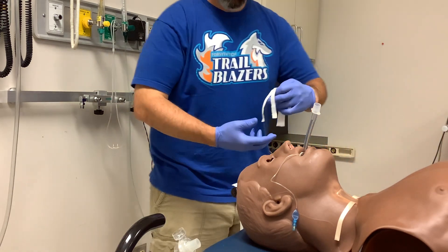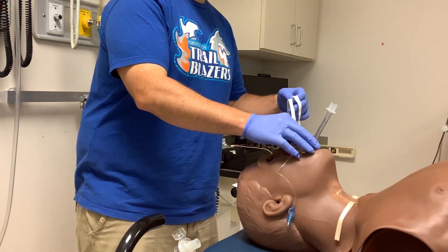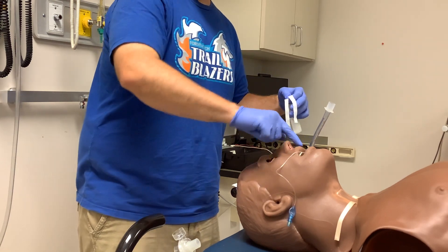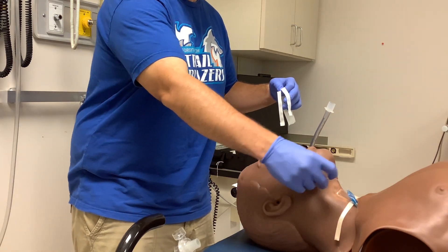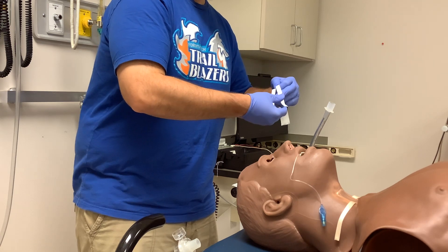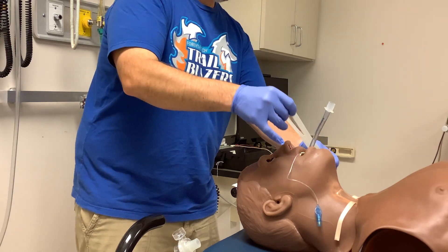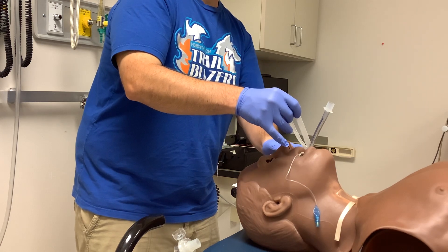Take your first one and decide if you're going to go to the right, center, or to the left. I'll put this on the left-hand side. They do have mastisol — it's a little tincture that you can put on to make the skin stickier, but because this is a fairly expensive mannequin, I'm not going to put anything like that on this particular mannequin.